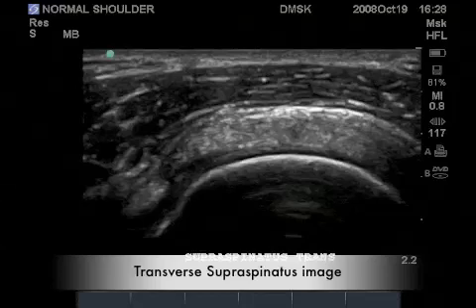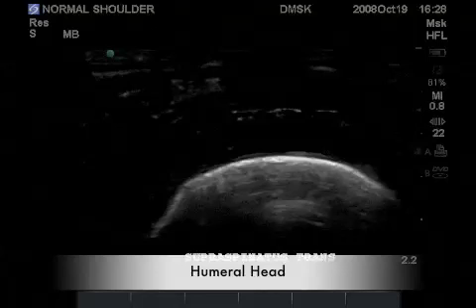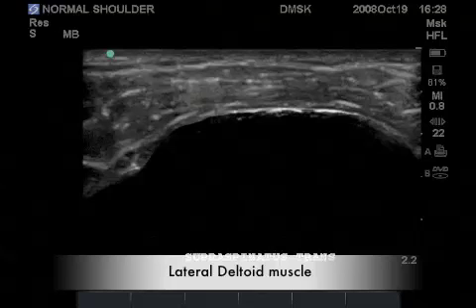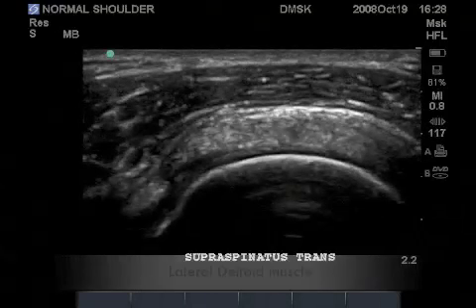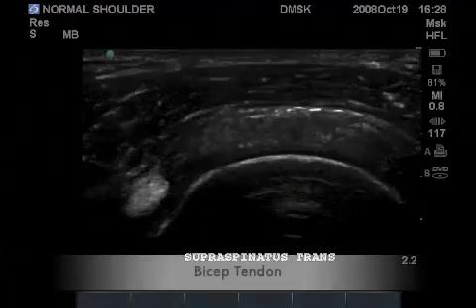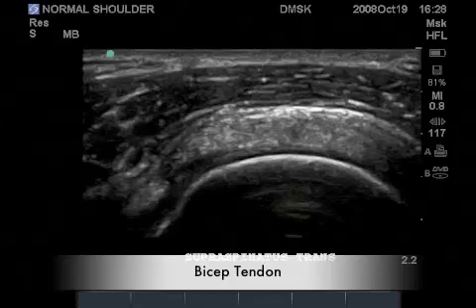This is a typical transverse image of the supraspinatus tendon resting near the biceps tendon. Here we have highlighted the humeral head with articular cartilage over the head, and the lateral deltoid muscle also imaged in a transverse orientation. This portion of the rotator cuff represents the true supraspinatus tendon. Shown here in the lower left corner is the biceps tendon — you can see how closely it follows the supraspinatus.